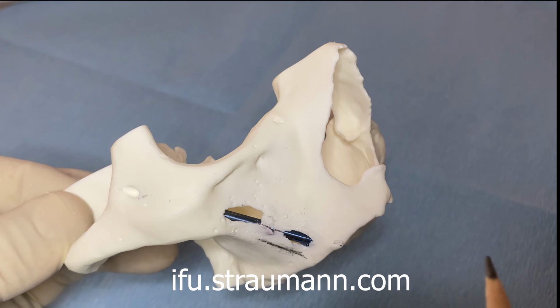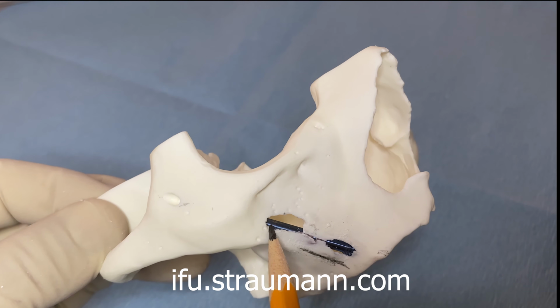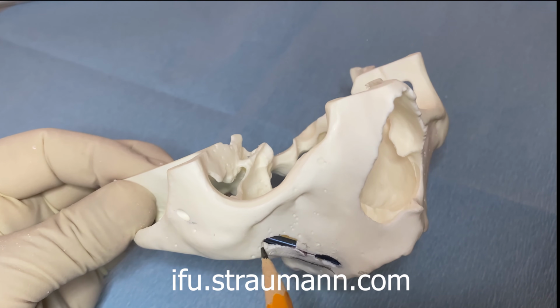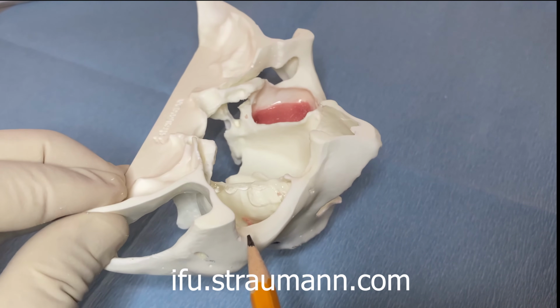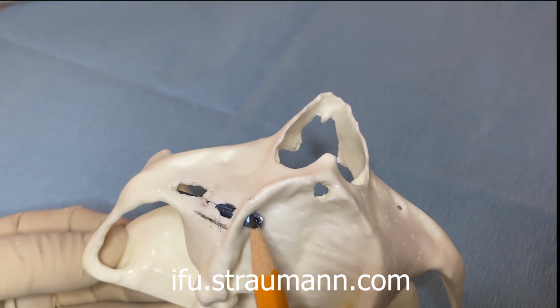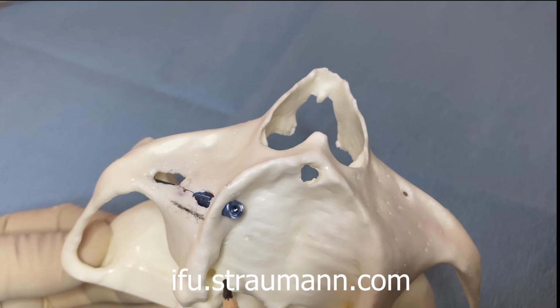All right, so in review, we can see that our implant is from the second bicuspid first molar, following the trajectory of the black dotted line, our sinus window being parallel to the black dotted line, and the back of the implant being parallel to the black dotted line. The implant is butt up against the lateral maxillary wall, so the tip will come out at the front of the zygomatic notch. Chances of it coming through the orbit are very, very limited, impossible when you have this trajectory. We have our implant flush with the alveolar ridge, and we are now ready to put on our SRA abutment if we're going to immediately convert.